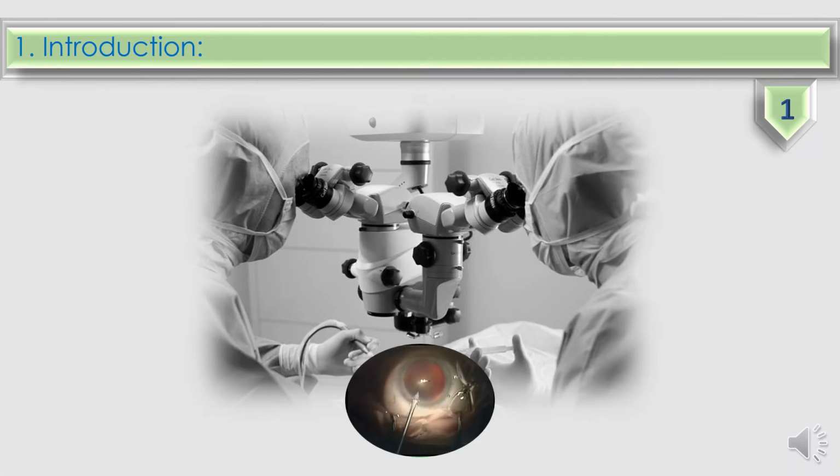Cataract surgery is the procedure of replacing the eye's natural lens, which suffers from transparency degradation, by an artificial lens. A binocular microscope is used during the surgery to enable accurately watching the patient's eye, and the output of this microscope is always recorded and stored for some postoperative purposes. Due to storage limitations in hospitals, however, these videos are deleted after a short time, and this great source of information cannot be fully utilized.